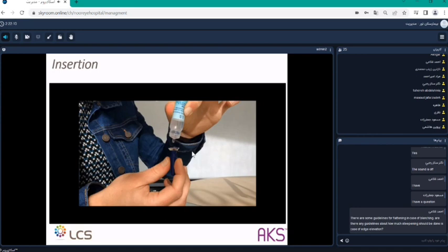So if one day you have a patient that you have fitted with a scleral lens, everything was okay, but if you see him after 1 month and during the check you see, wow, a diffuse staining when you remove the lens, well, you have the answer. The problem is not your fitting. The problem is that your patient is using a solution that has preservatives in it. So you need to insist that it has to be used only with a preservative-free saline solution. Of course, no soaking solution inside. I say that because I have seen some patients who have done that. Of course, that is forbidden because that will cause, once again, diffuse staining.